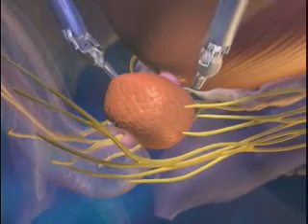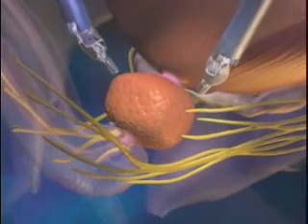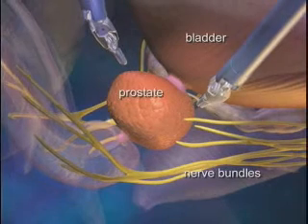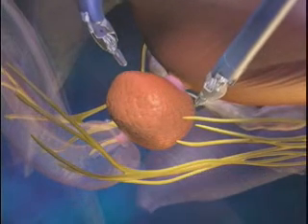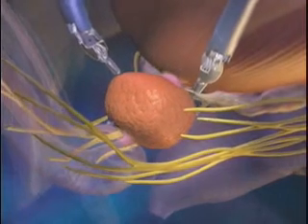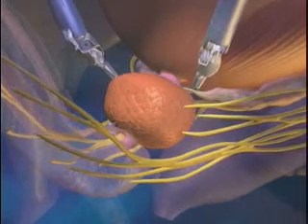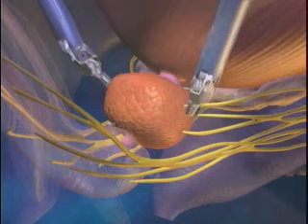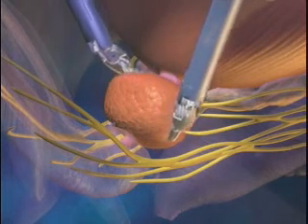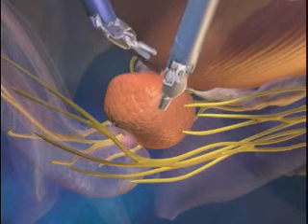Looking inside the pelvis, the anatomy around the prostate consists of muscles and delicate nerves that affect both urination and erections. During the removal of the cancerous prostate, your surgeon works to spare these very delicate structures utilizing the articulating DaVinci instruments and a highly magnified 3D view of the anatomy provided by the system.